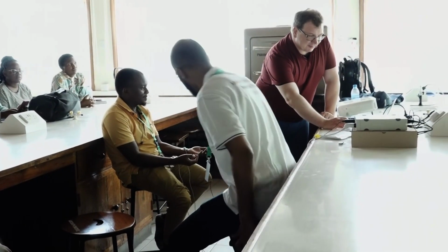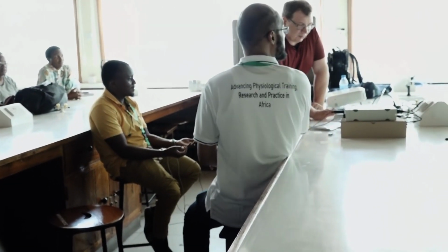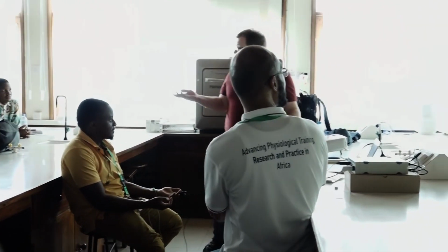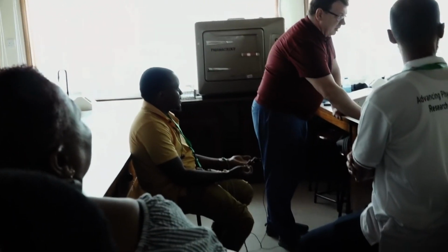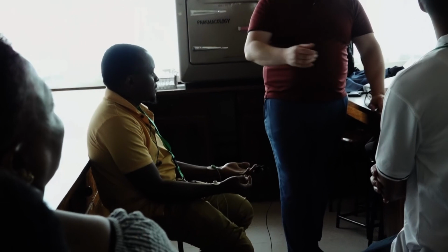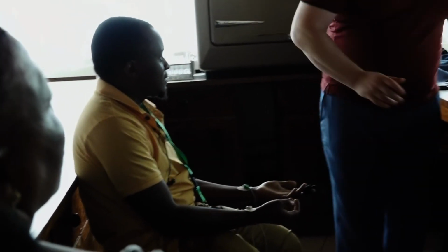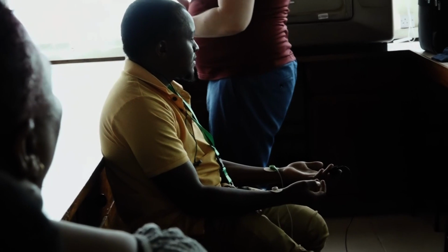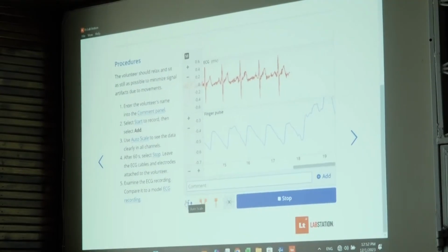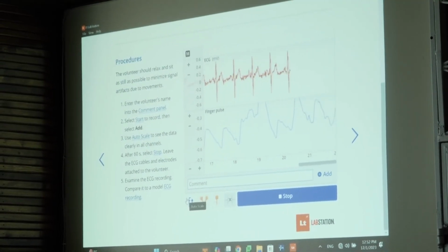And then we move on. And as I said, anything that looks like a link is a link. So it opens a pop-up so that students can see more and understand better. It shows you how to do it. The idea behind this is we wanted to put in as much information as possible, but not overflow the students with information. But if they understood it and want to learn more, they'll find it. So that's the hope. Keep the arms really relaxed so you don't have any tension.